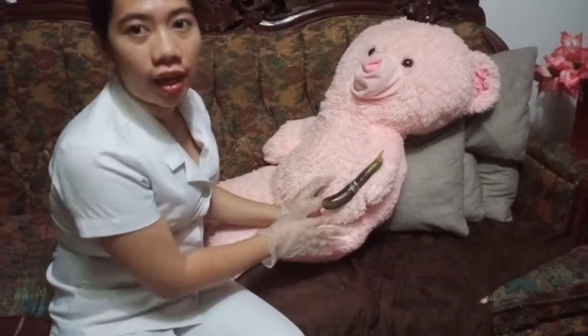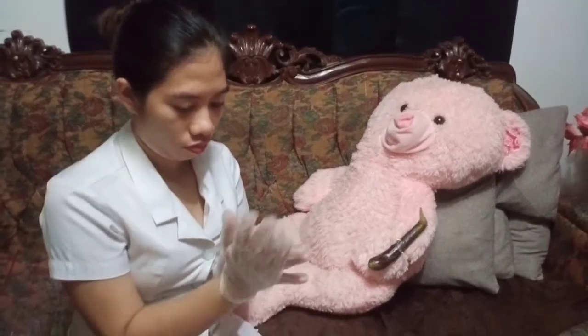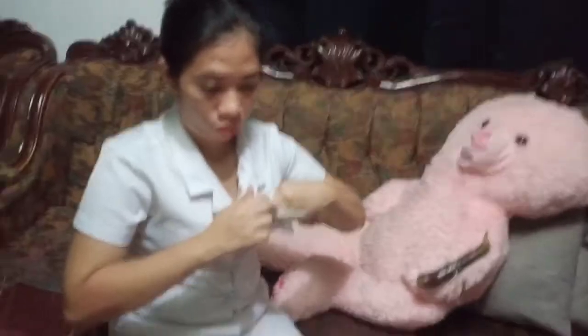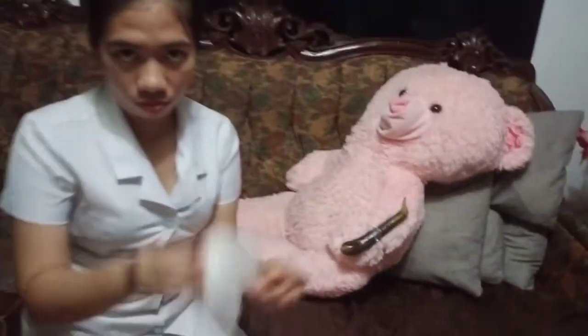Then remove and discard gloves. Now we're done. I perform hand hygiene. I'm done hand washing, and I'm applying alcohol to deter the spread of microorganisms.